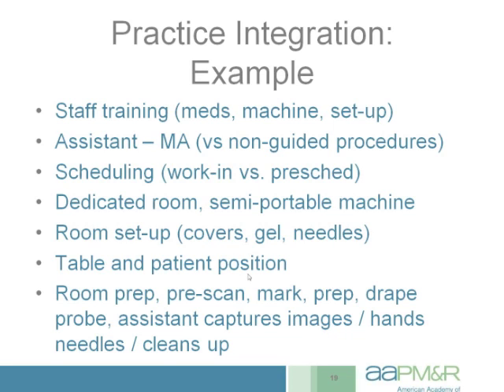As much as possible with ultrasound-guided procedures, I like to have the patient laying down. So even if I'm doing a shoulder procedure where it may seem like it would be better ergonomically to have the patient sitting up, facing away from me, and me on my stool immediately behind them, particularly if you're dealing with an ultrasound probe that's sitting on ultrasound gel, the patient doesn't have to move very much for you to lose your image. So as much as possible, I like to have the patients laying down to help keep them in a fixed position, because you're already dealing with a probe that can be sliding around on gel, and it's all too easy to lose your image otherwise.